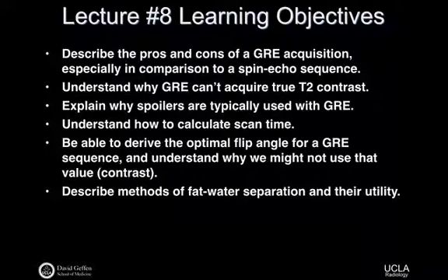The number of phase encoding lines, or the number of lines of data we want to acquire from that experiment. We'll get into that a little bit more today. But that's an important consideration because I want you to start thinking about what is the TR. Well, the TR sounds short, 10 milliseconds, that's pretty fast, right? But then you multiply 10 milliseconds by 100 lines of data you want to acquire, and all of a sudden it takes you a second to get an image.